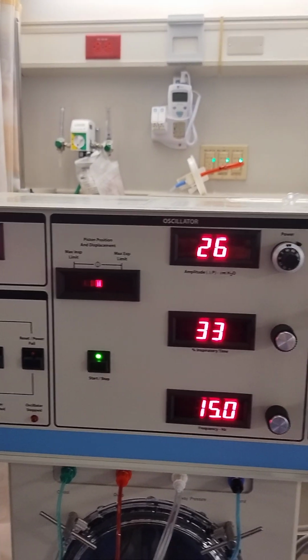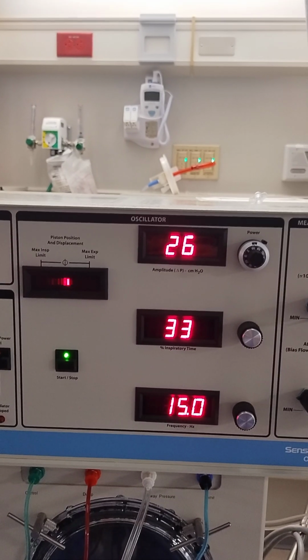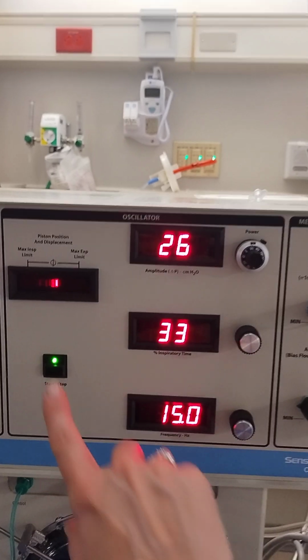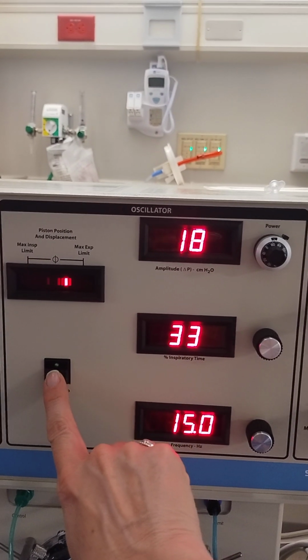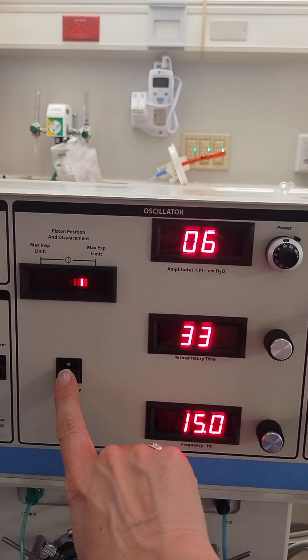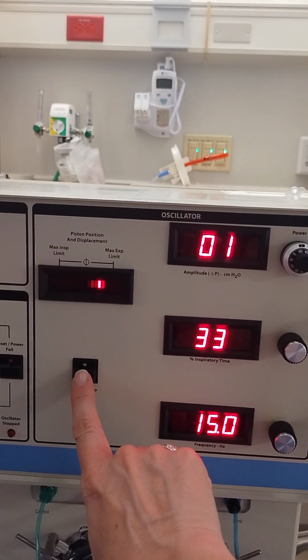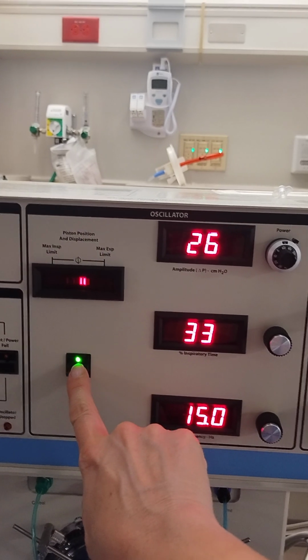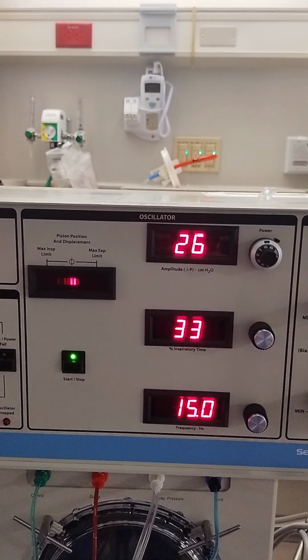The next thing to be mindful of is the piston only needs to be stopped here when the provider wants to listen to the baby's breath sounds. We will maintain our mean airway pressure during that time. They finish listening, okay, we're starting the piston back again.